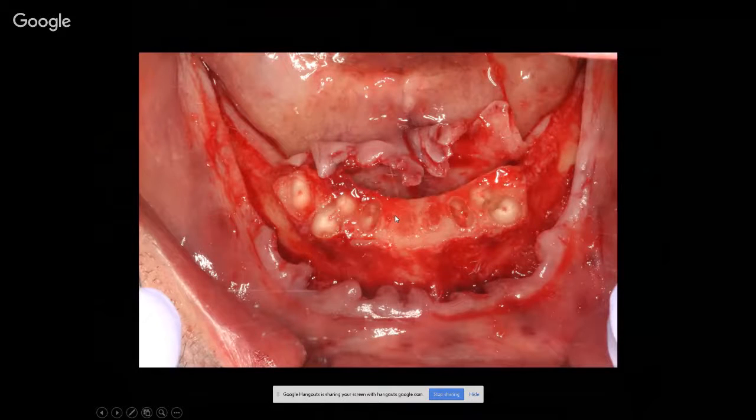So essentially what we did was reduce the bone and the teeth all in one piece. I get questions over and over on why I did it this way. In the treatment plan for this case, I used the dimensions of the teeth and the proximity of the teeth to place my implants in the guide digitally.